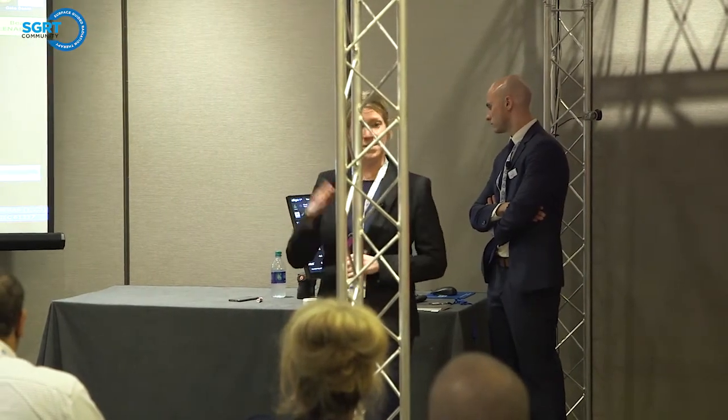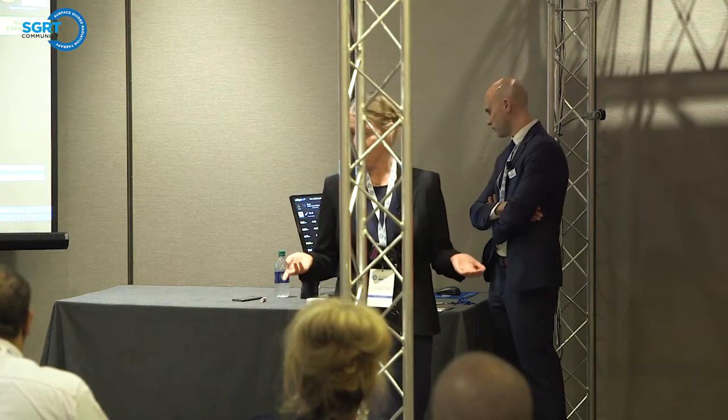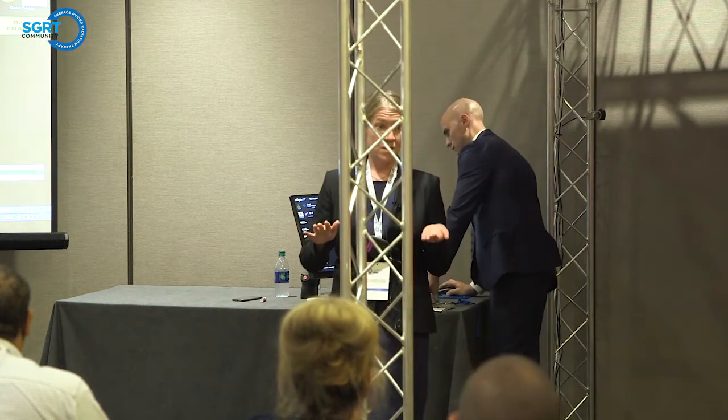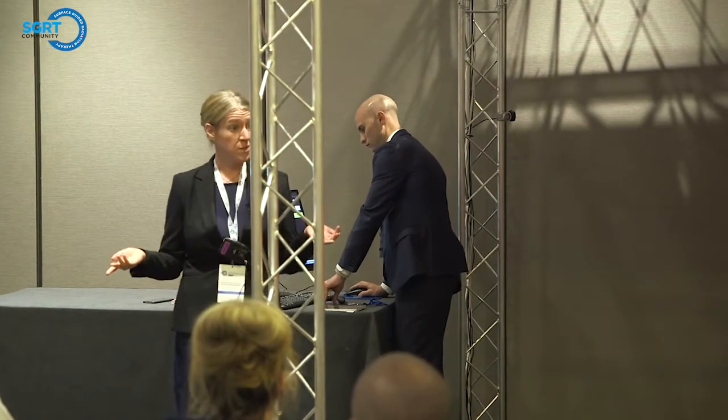Okay, so since we're in position here, now we're going to step outside the room and take our images. Up to your clinic protocol, if you're imaging every day, you'll go out and take your images. And then let's say from our image, now we have a shift from what OSMS is telling us. We have a shift there that we see in our films.